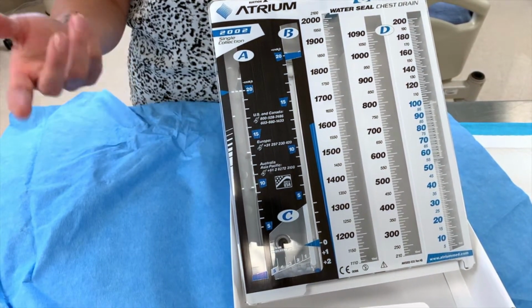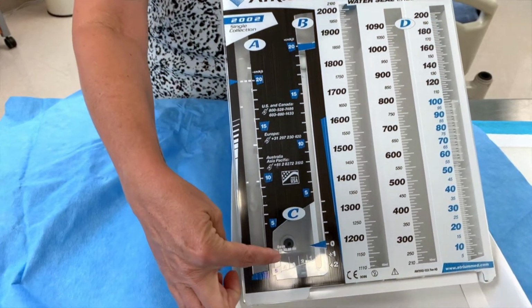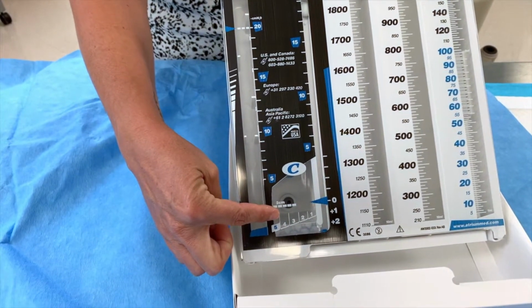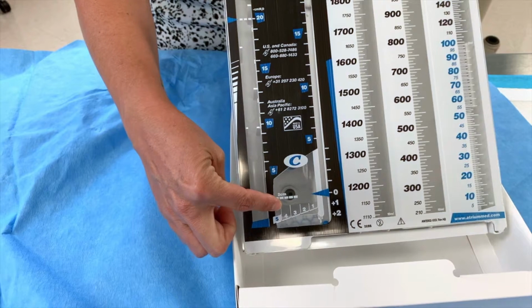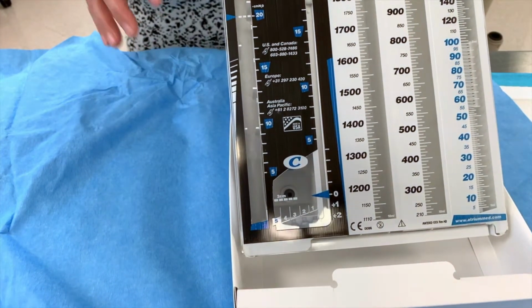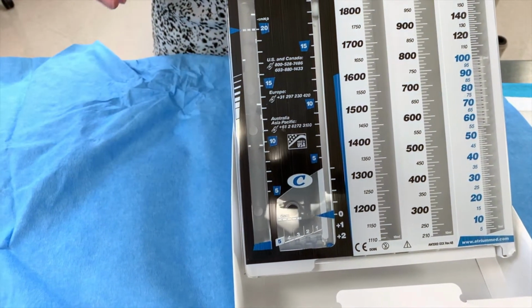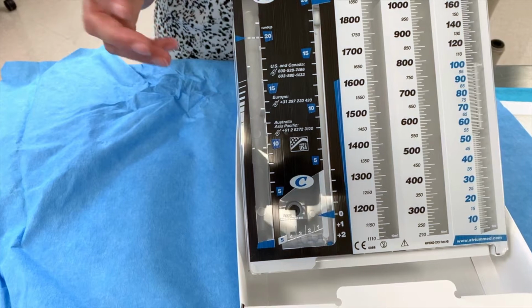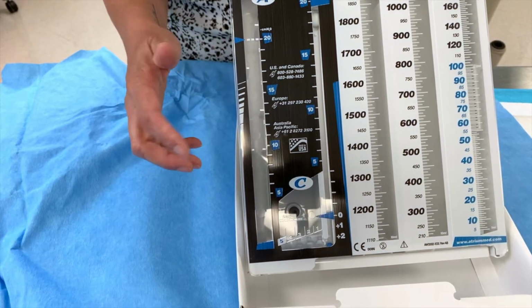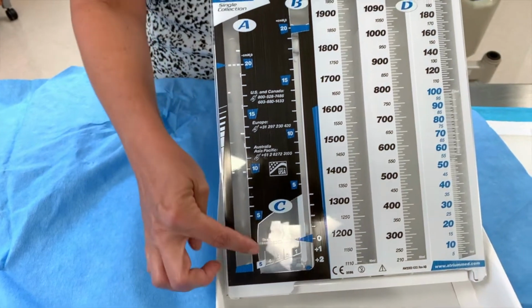The next chamber that you'd be watching and monitoring as you care for a patient with a chest tube is this second chamber here. The second chamber is the actual WaterSeal chamber. This is where you are going to be looking for bubbling for your patient, either continuous bubbling or intermittent bubbling, and you have to know what type of bubbling is the correct bubbling for your patient. So this is where you'll look for that.